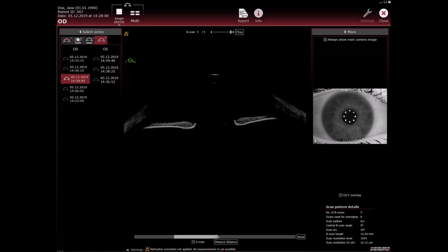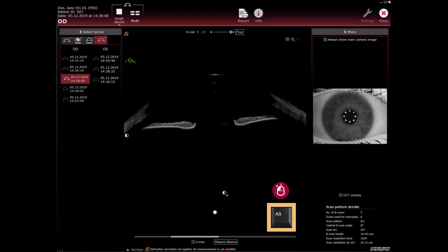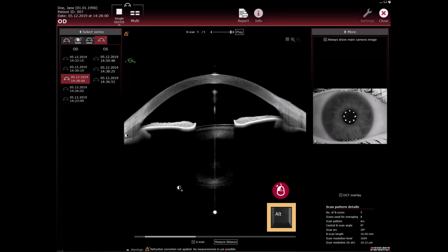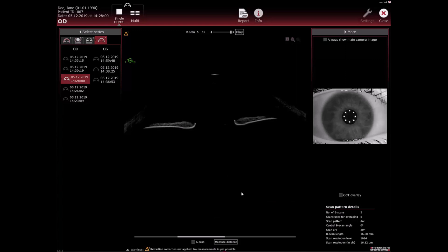Alternatively, hold down ALT on the keyboard until the mouse cursor switches to the contrast icon. Move the cursor up and down or left and right while holding down the left mouse button to increase or decrease image brightness and contrast.